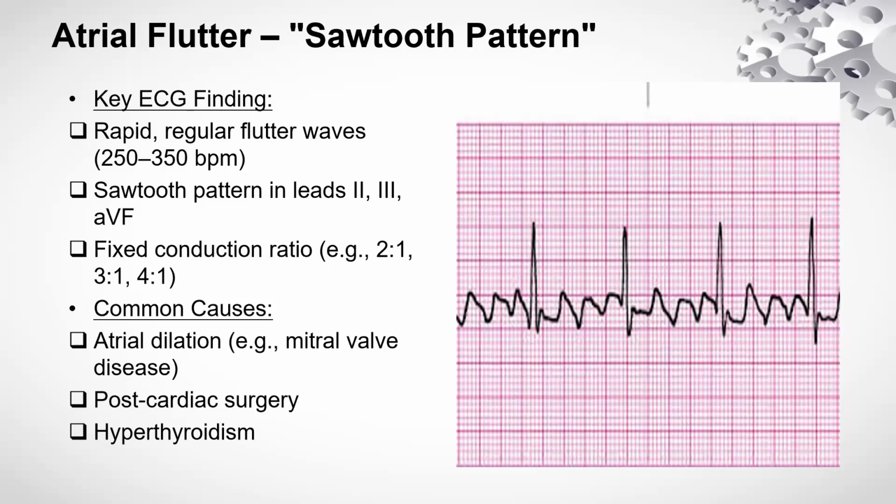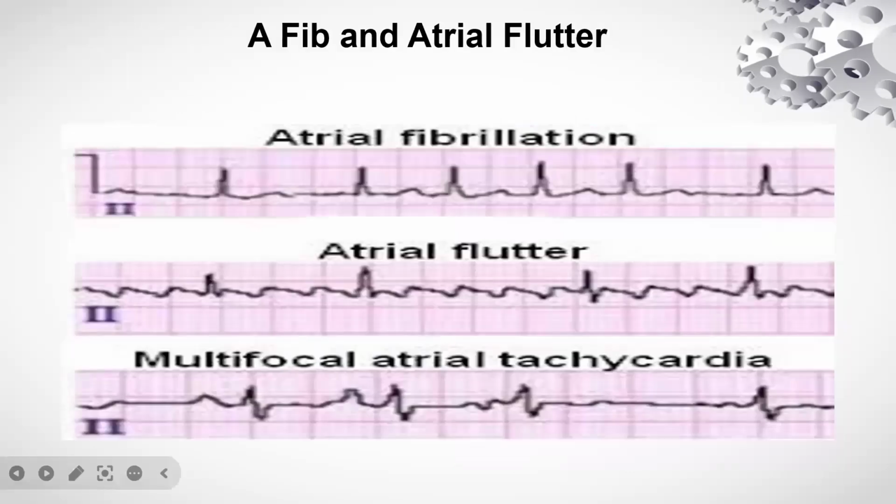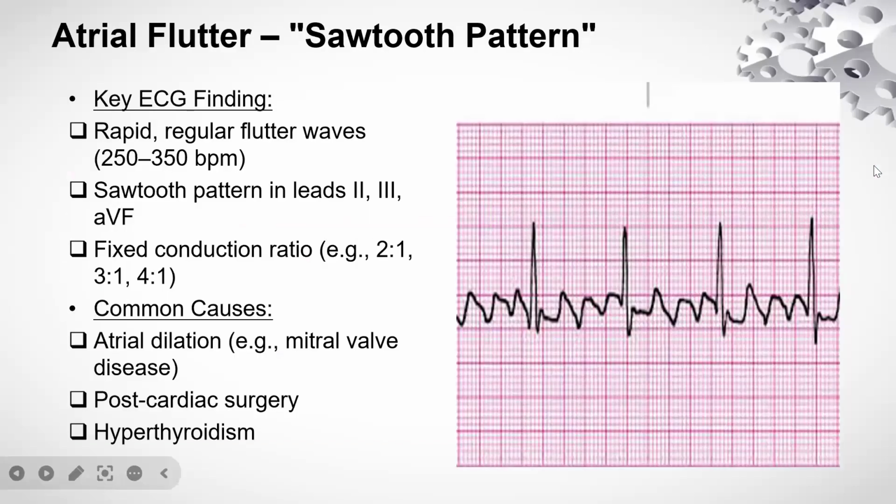And then to look at if it's regular, let's count the number of big squares between the RR interval. Look at it.